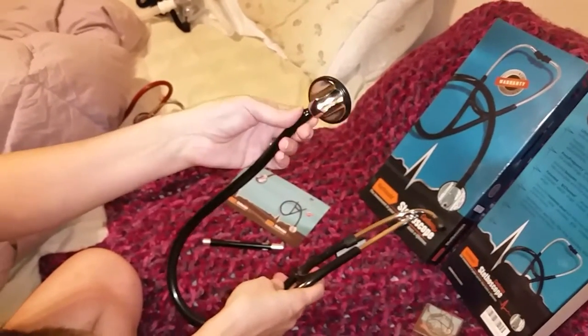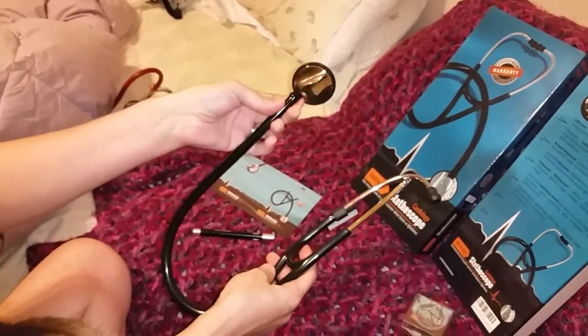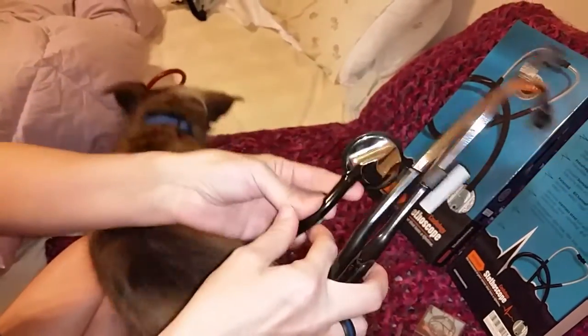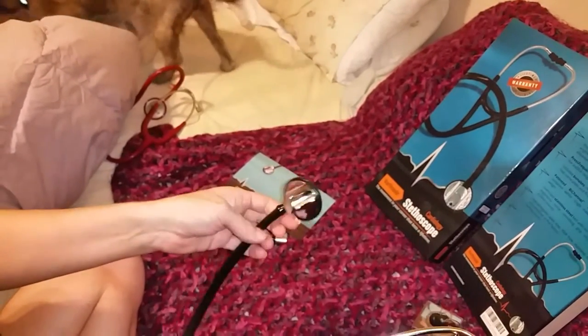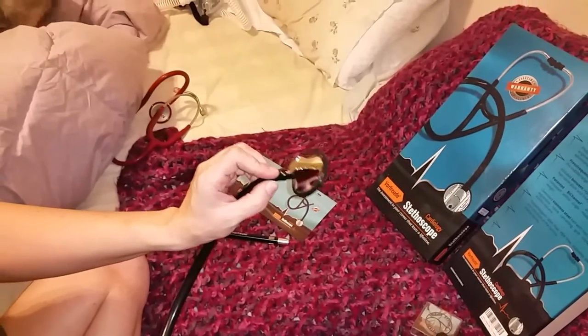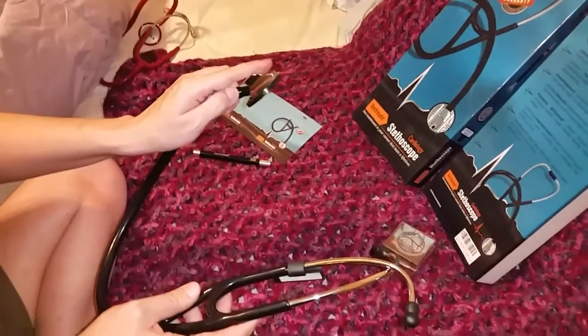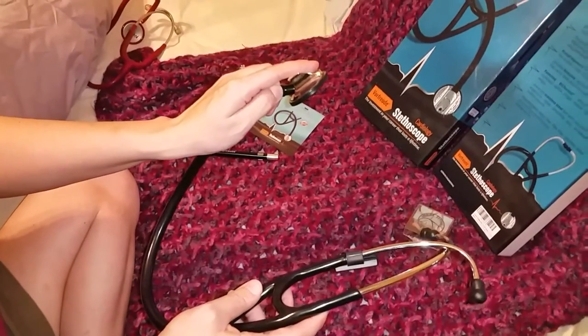This part is slightly oversized. Now since this is for cardiology, it does pick up different frequencies. For lower frequencies, you just place it on the chest lightly. If you want to pick up the higher ones, you just press a little bit harder.